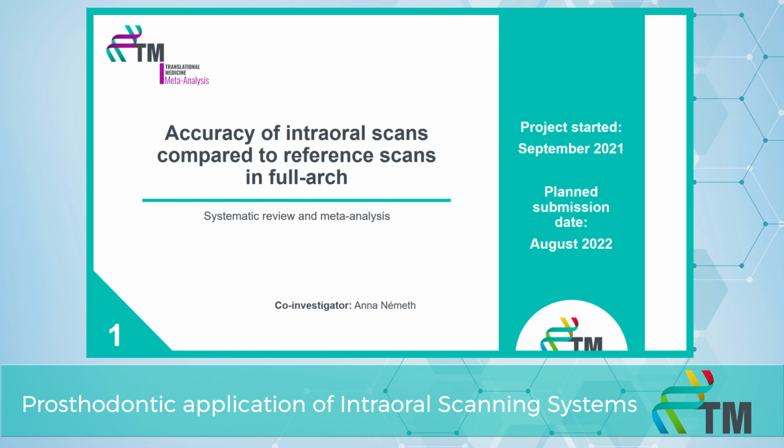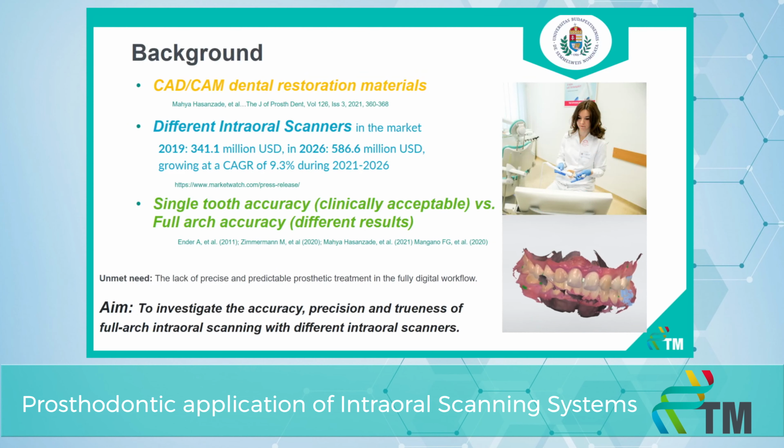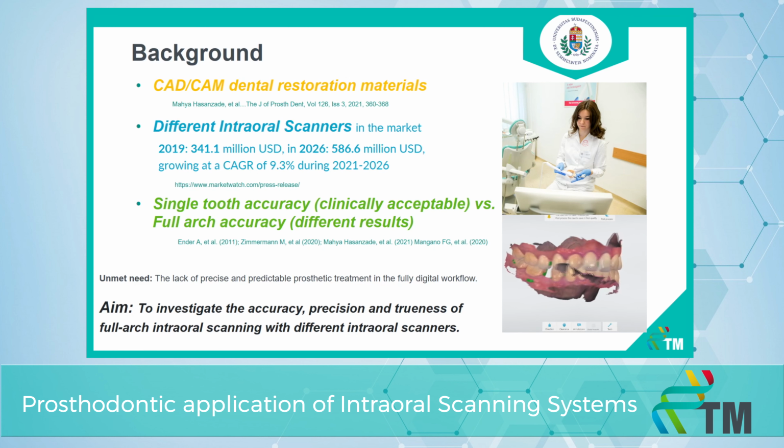So the first meta-analysis, as I said, is the accuracy of the intraoral scans compared to reference scans in full arch cases. Dentists have a very wide range of dental restoration materials that we can use, and most or some of these restoration materials can only be manufactured with computer-aided design, computer-aided manufacturing techniques, as you have heard before from Anna and Peter, of course.